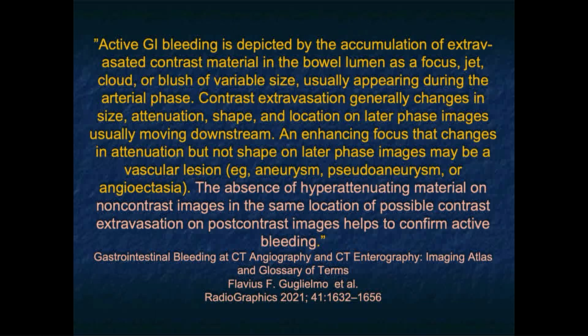One of the challenges about doing GI bleeding is the protocol. I think at the end of the day, when you're unsuccessful for detecting GI bleeds, it typically revolves around protocol. I'm not giving a talk in this meeting on errors and misdiagnosis, but I will say that one of the things I think we all have problems with as we get busier and busier and spend less time with the technologists, the quality of studies tends to decrease because of lack of input.